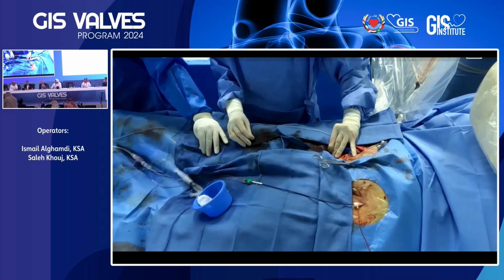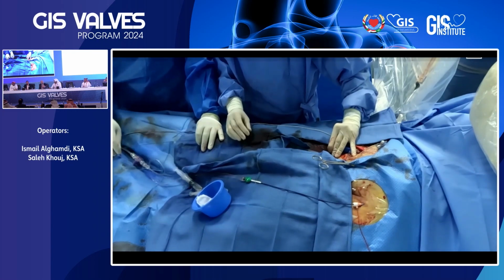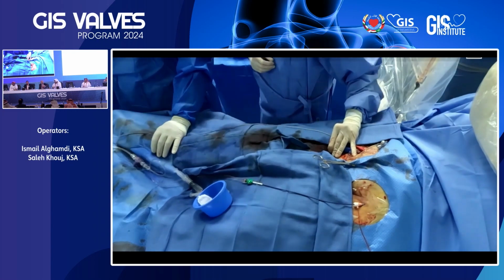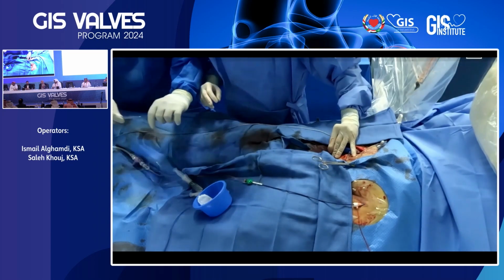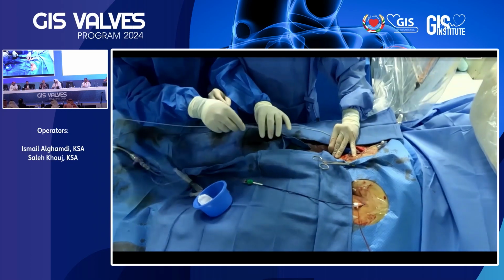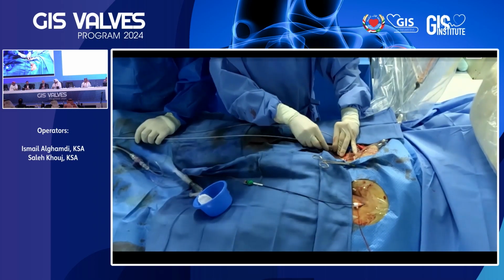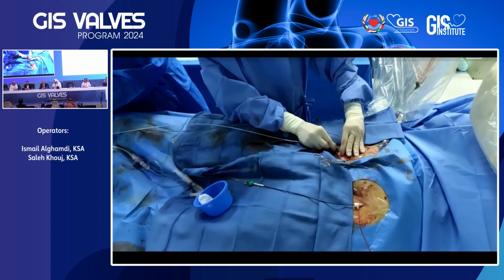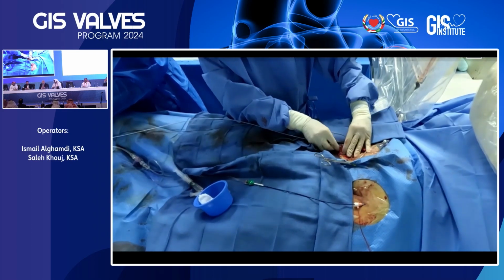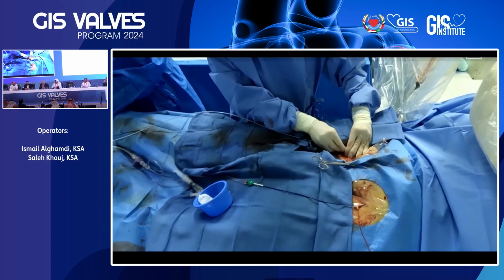The other reason is low preload, such as mitral stenosis, mitral regurgitation, tricuspid regurgitation, RV failure, and so forth. So if you put it all together, you need to have all those parameters and think correctly. Are we dealing truly with a severe AS? Then you can resort to the calcium score. Calcium score is important. In this patient, it is high. So all that together confirms the possibility of severe aortic stenosis.